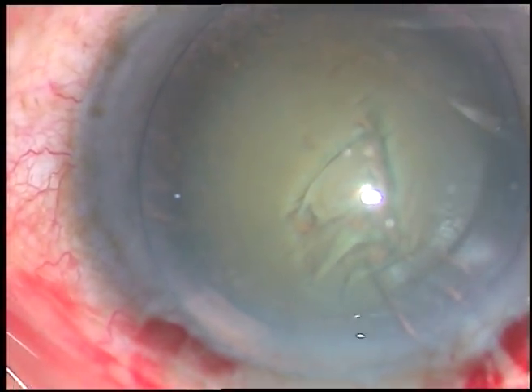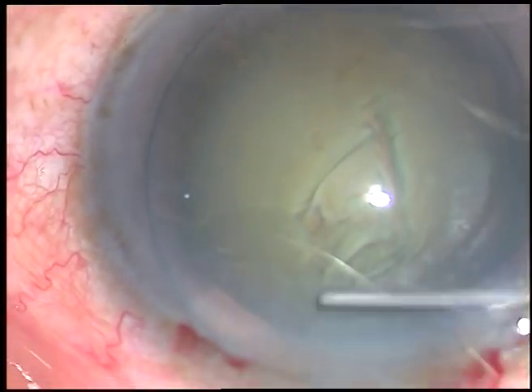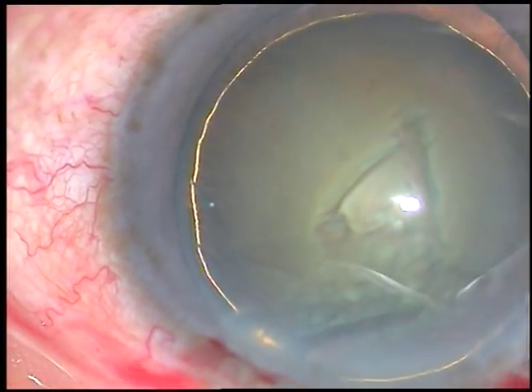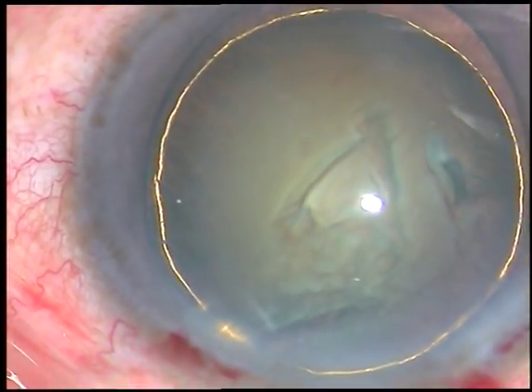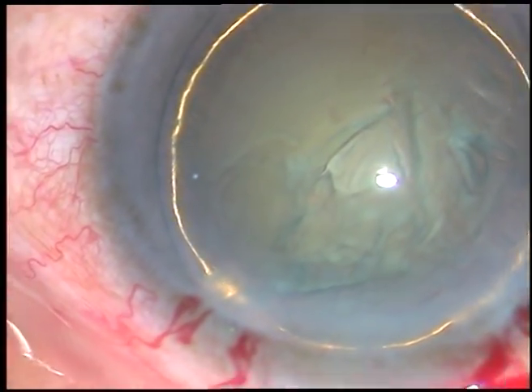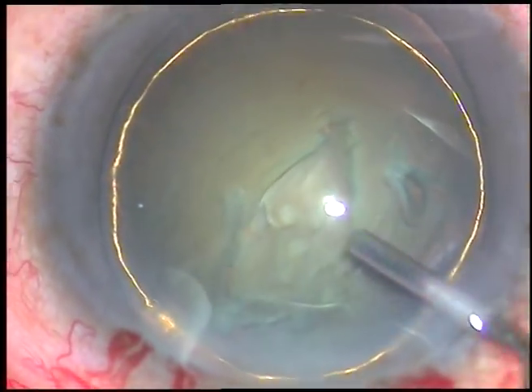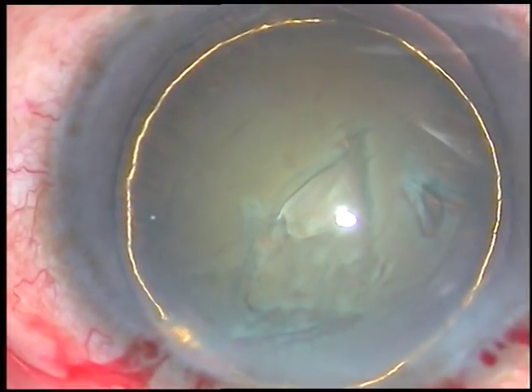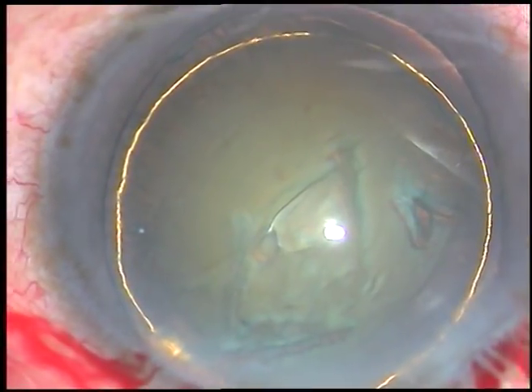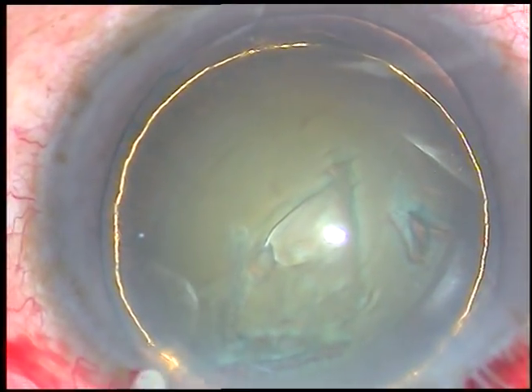Now hydrodissection is done. A fluid wave is passed just underneath the anterior capsule. Hydro-delineation is done and the nucleus is tapped. But I didn't rotate the nucleus nicely — just gave a nudge to the nucleus. And now I'm going to manage the nucleus.